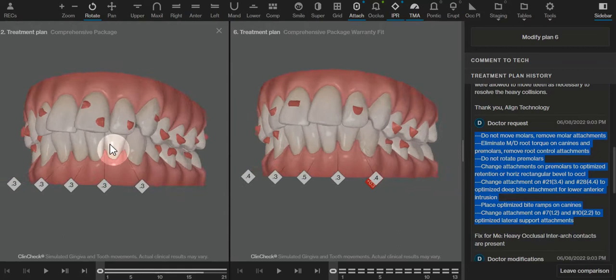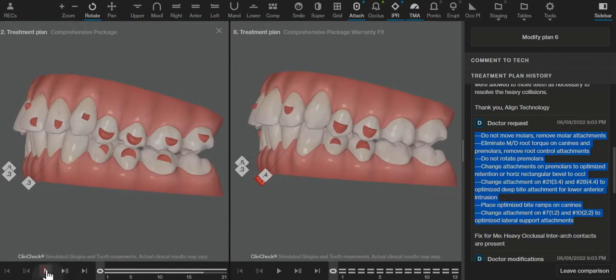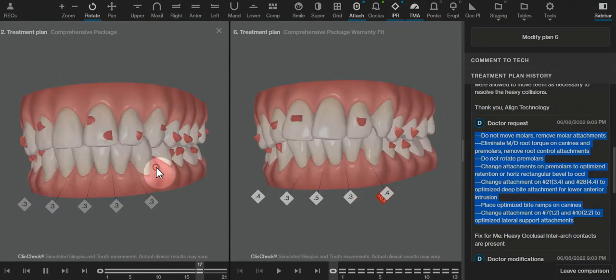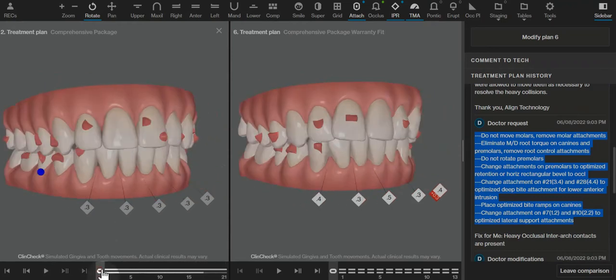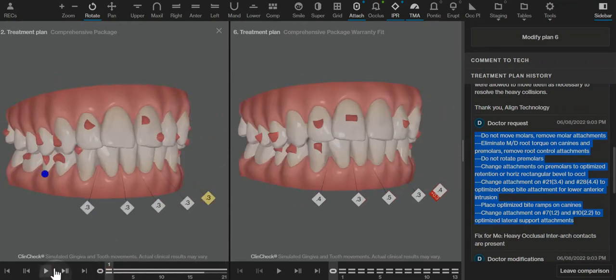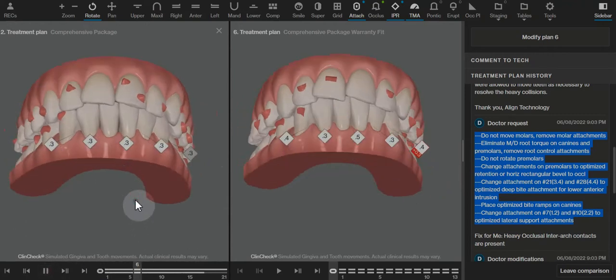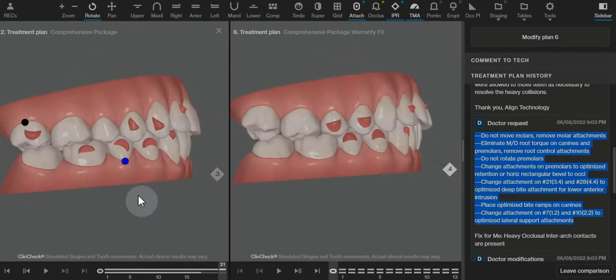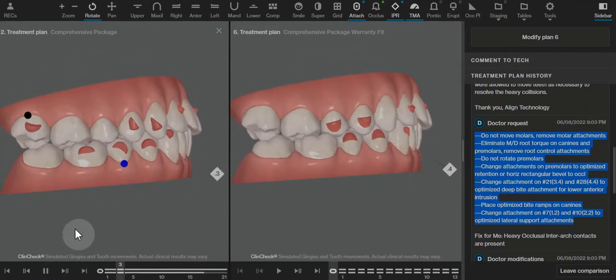Looking at this ClinCheck plan, when we go through, I can see a lot of molar movement, trying to move this second premolar. That's not going to be a predictable movement, even with an attachment. The anterior looks like this might work pretty well, and we do have some lower IPR, which fortunately helps finish with a nice amount of overjet here. And then you can see even more molar movement on the other side.